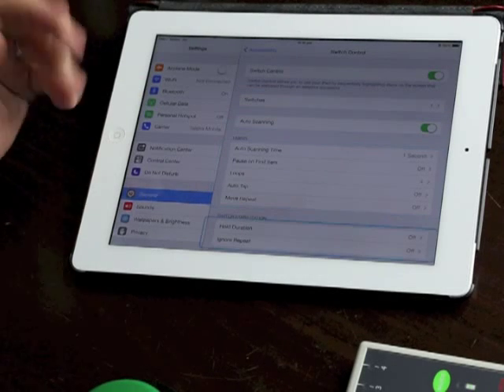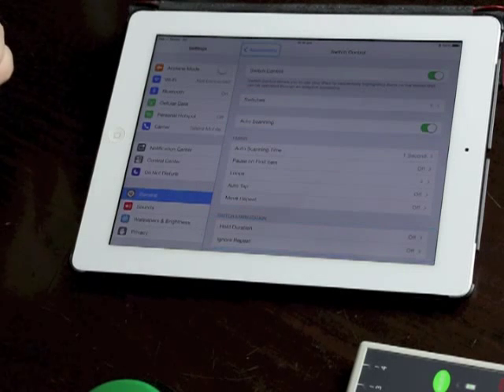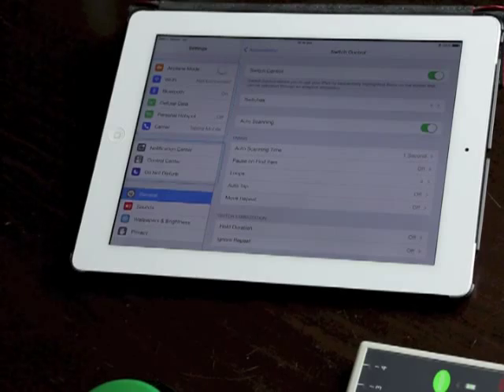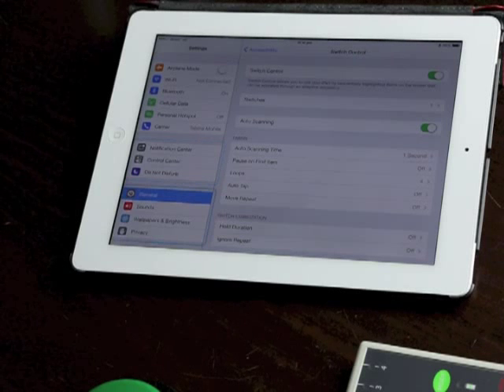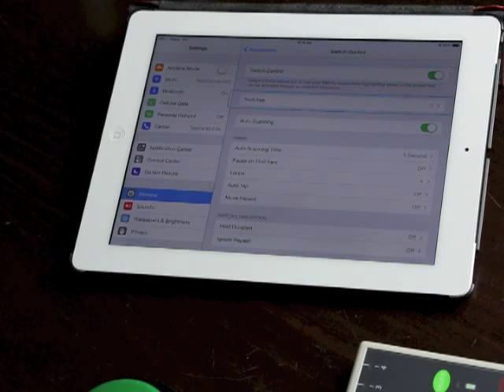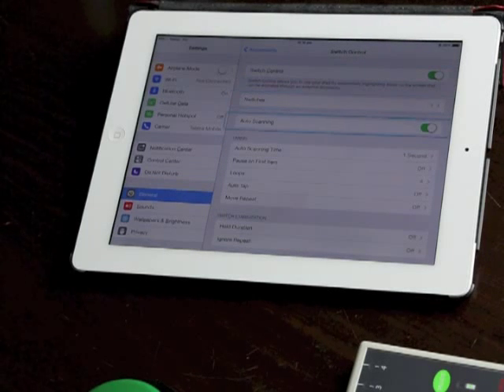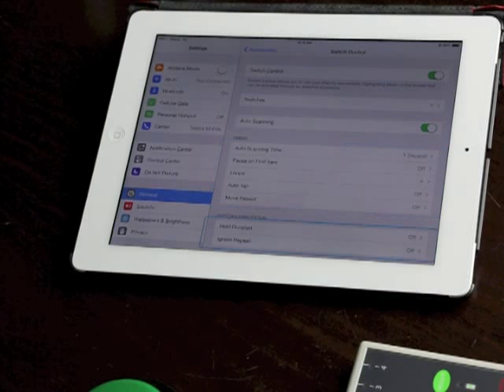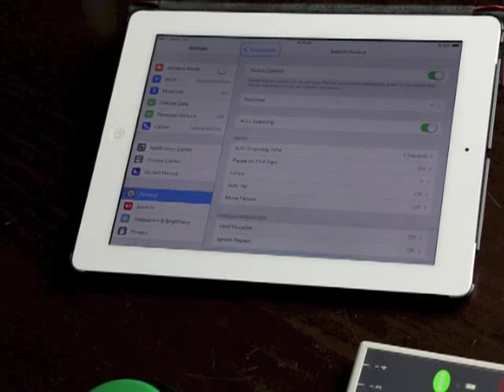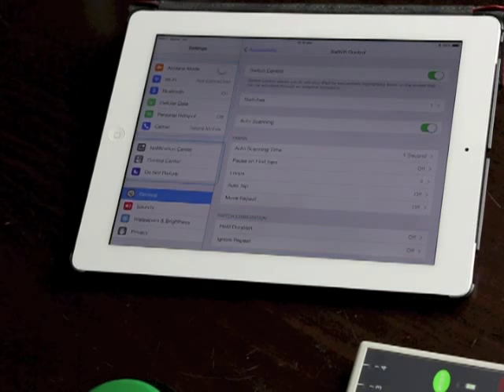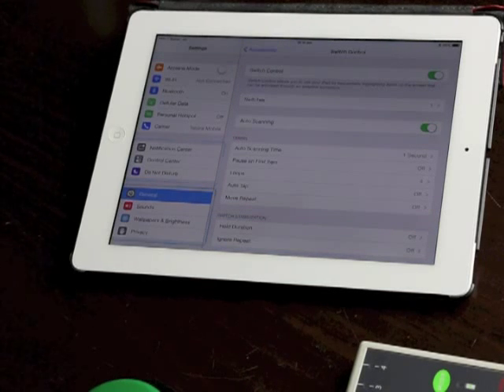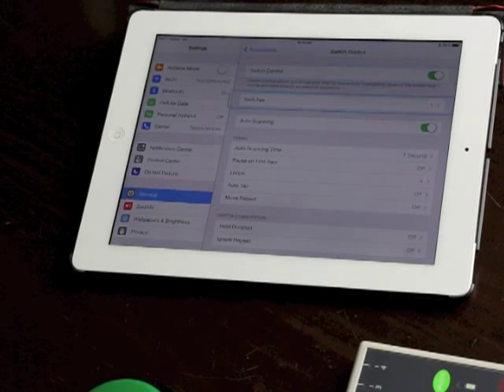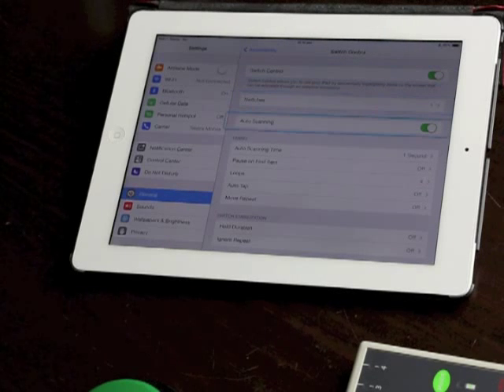Switches we already went into and we set up this switch. Auto scanning is what's happening now so the cursor is moving around the screen by itself and we just press the switch to interact with it. In a future video I'll show you two switch scanning with auto scanning turned off but for single switch we need the auto scanning on.